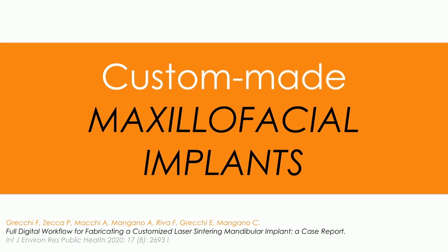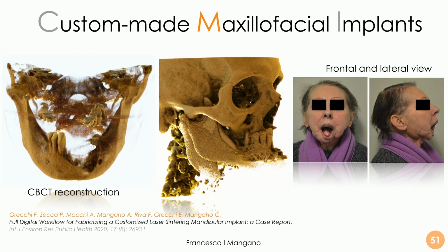And I conclude with another option that is even bigger, the possibility to use CBCT data for making custom-made maxillofacial implants. This is a beautiful case made by Professor Francesco Grecchi, and it's very important to see how the digital tool can help also the maxillofacial surgeons in order to treat very challenging and difficult patients, difficult situations.